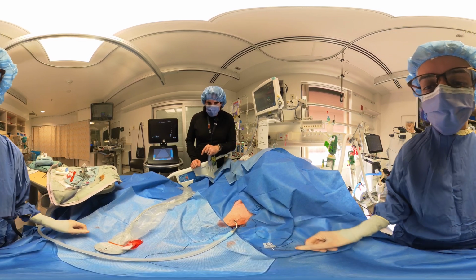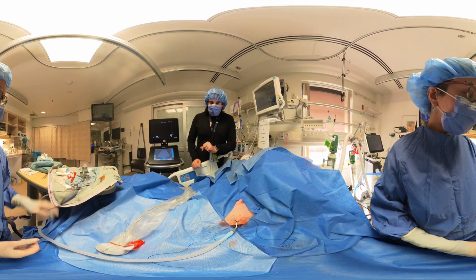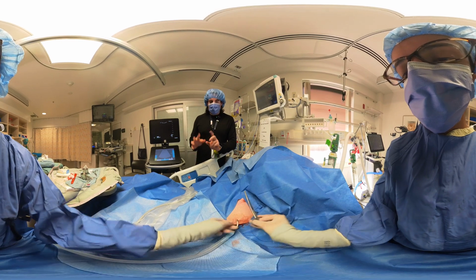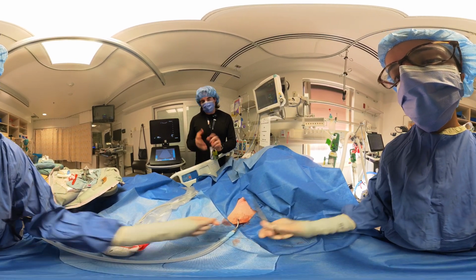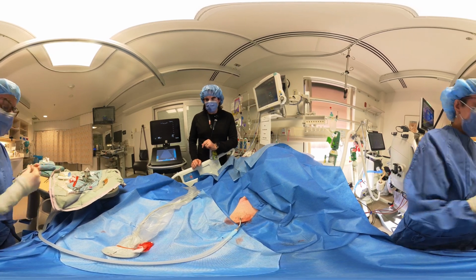You are connected. Okay. So here we're going to put on a bit of suction, just to -20, to help drainage. We can cut off these tails of the suture material as well. Now we will put some bandages over the patient to make sure this area stays clean. Okay, and that's it.